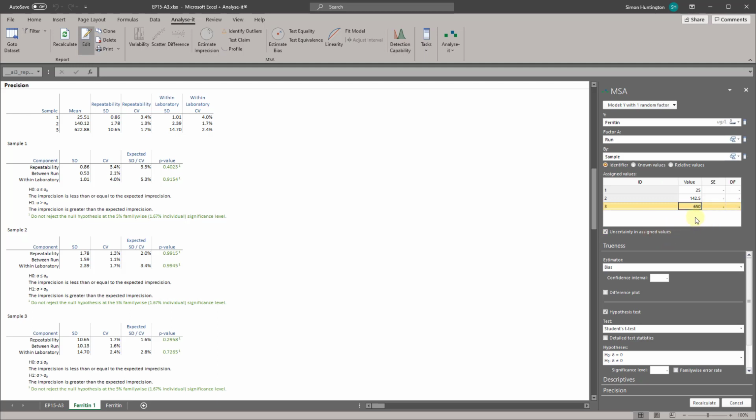Select the Uncertainty in Assigned Values checkbox, and then in the Assigned Values grid, type the SE and the DF. The standard error, SE, of the assigned value depends on the source of the assigned value. Reference materials usually are accompanied by a standard uncertainty, whereas proficiency testing materials usually specify the SD and number of laboratories. The standard error, SE, and degrees of freedom, DF, should be computed using the formula in the CLSI document.